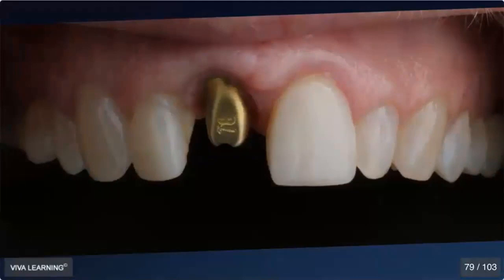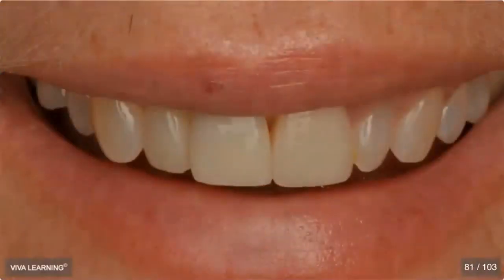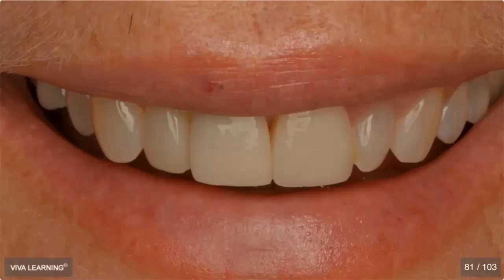So here's after uncovery, or I'm sorry, after transition to the final abutment. So a customized abutment was made, and the dental student milled a crown in this case, and here we go. There it is in position, and the final smile. So, you know, in my hands, using this process makes doing implant cases like this pretty predictable and easy. And where before I might have lost sleep over a single central incisor with deep bite occlusion and difficult gingival aesthetics, now we can put it in the hands of dental students and residents, and they can pull off cases like this. So it's really, really nice.